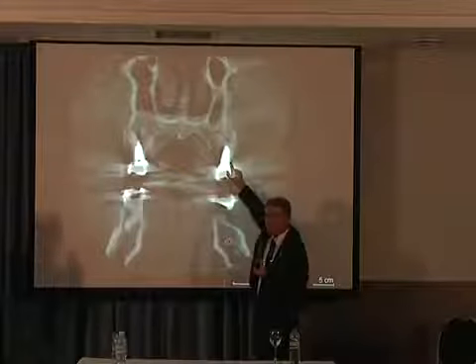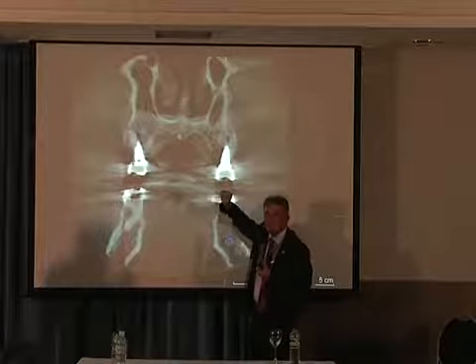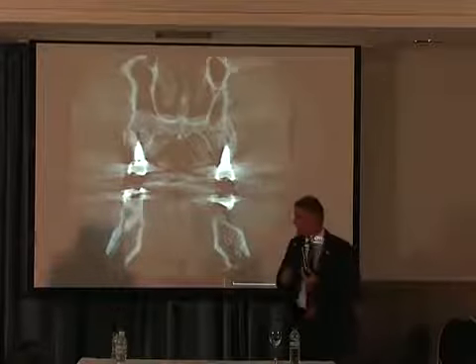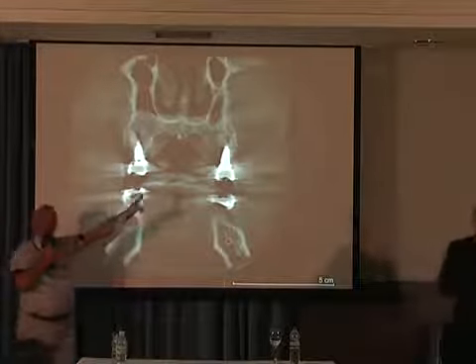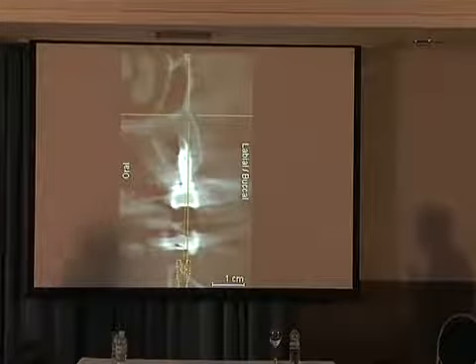When you look here on the frontal section, it's very nice. On the cone beam CT, you can see what happened with the buccal plate of my previous implants. Sometimes it's amazing, yeah? Sometimes it's nice if the buccal plate is there. This is the holy cow, the buccal plate. And on this image, it is sometimes very nice and pleasant to see your previous work, when the buccal cortical plate has remained so well preserved after so many years.